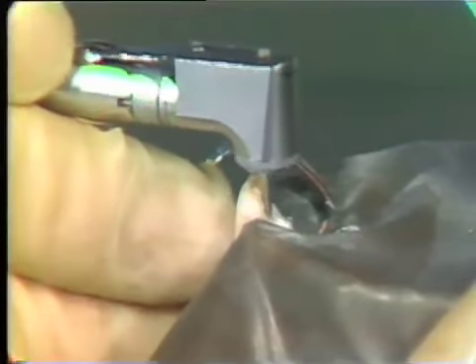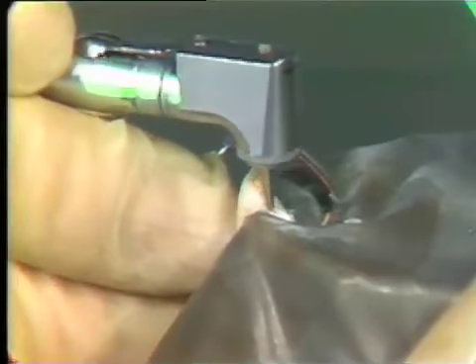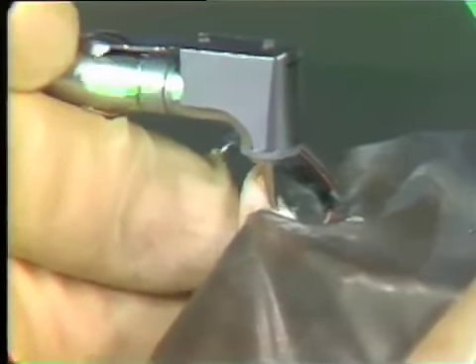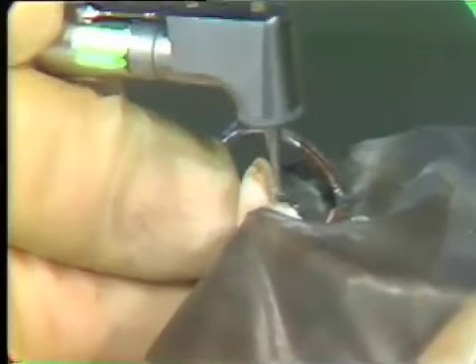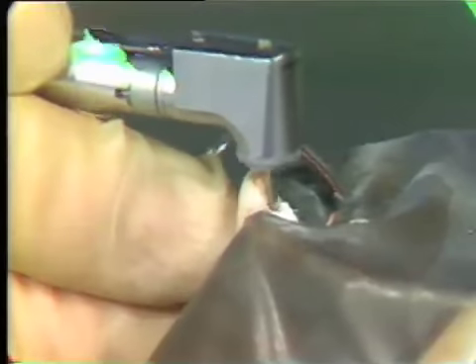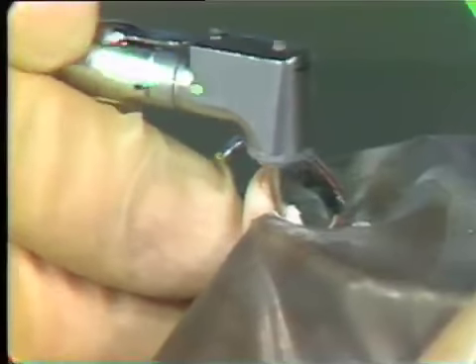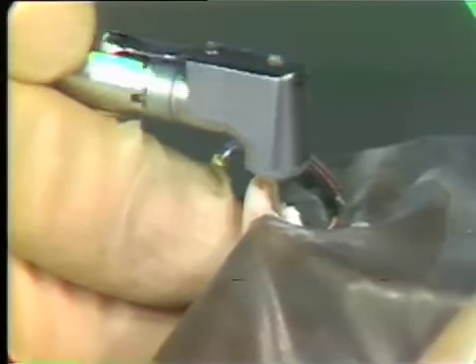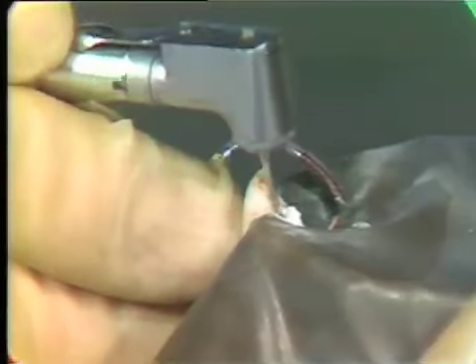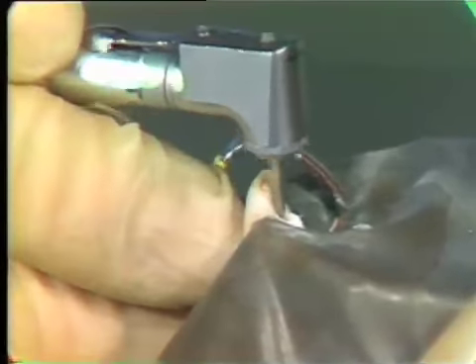Working from the inside out, I go against the mesial, the distal, the buccal, and the lingual, unroofing. I go back and check and see if I can go from the inside to the outside without feeling any roof. I feel a little bit on the lingual, so I go back and unroof.